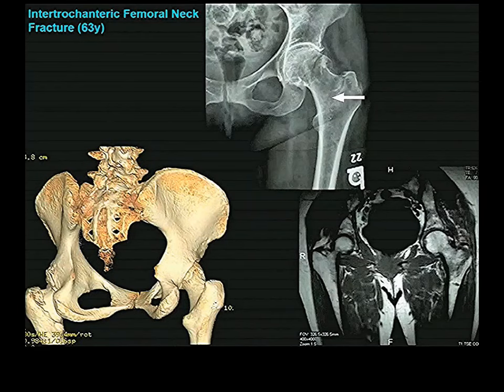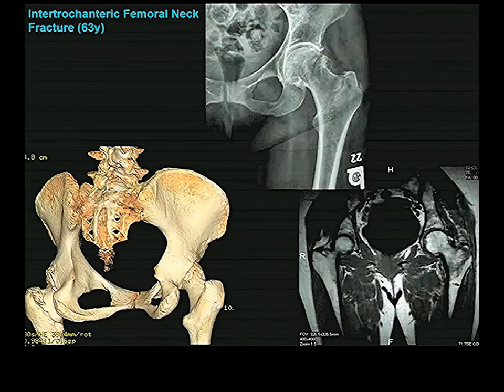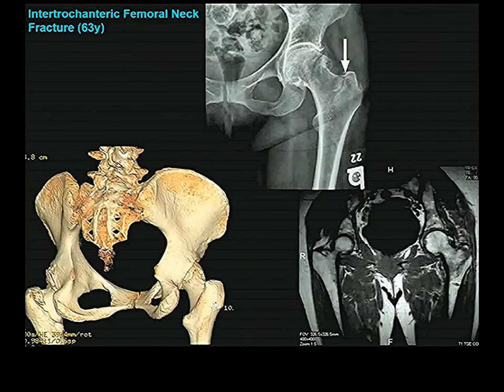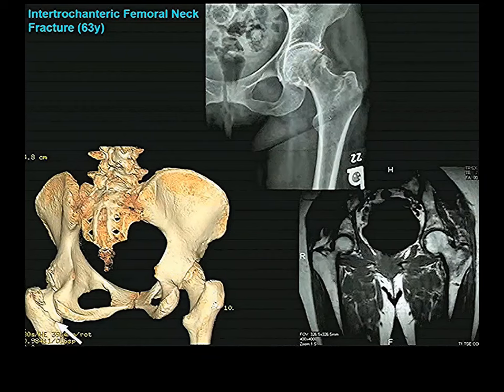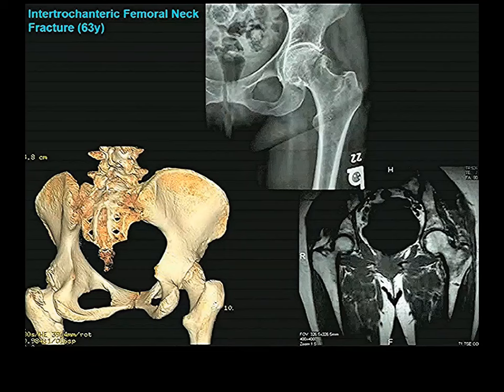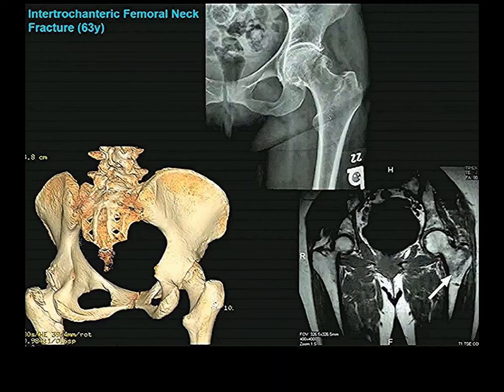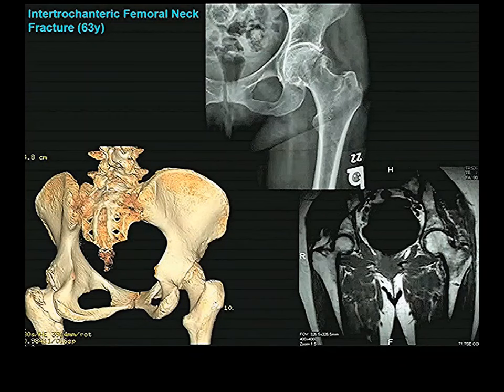Here is an intertrochanteric fracture. You don't see it clearly on plain film — even the radiologist didn't see it initially, noting only a small fracture of the greater trochanter. But on CT with volume rendering, you can see the intertrochanteric fracture line. On MRI, the intratrochanteric region looks very different on the affected side compared to the normal side, generally due to swelling and edema.